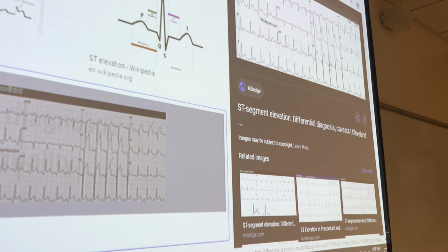So why am I mentioning it? What happens is, if you survive this MI, you will have changes in the EKG permanently. So let's say 10 years later, you have another MI. Obviously, if we just look at your EKG, it'll be forever changed from the previous one. So what we need to do is compare the new EKG to the one after your MI to see if there are any further changes in an EKG. Your cardiac muscles never repair themselves.